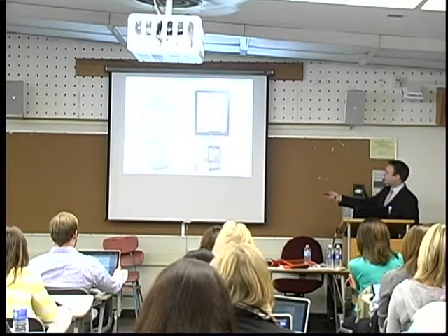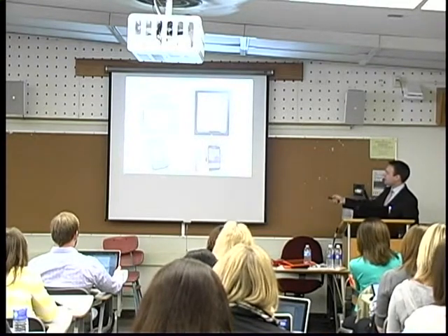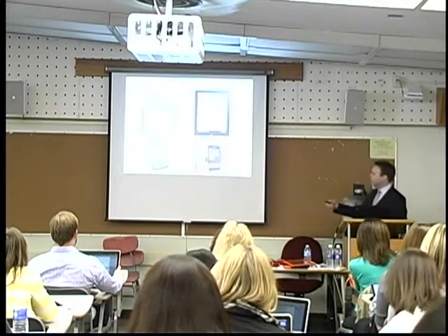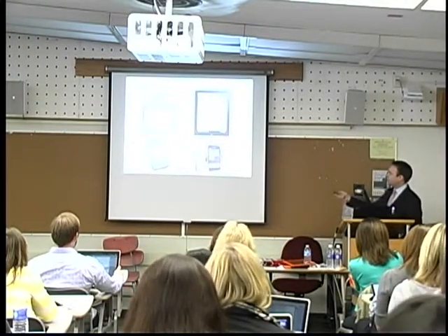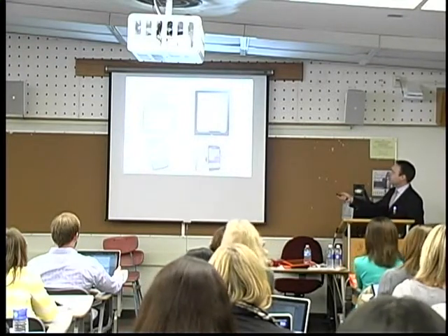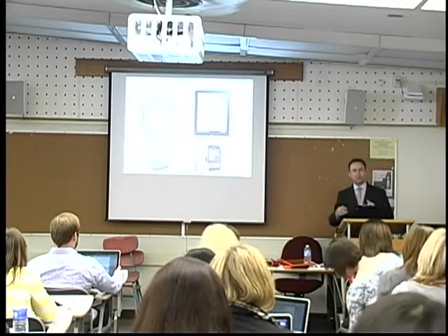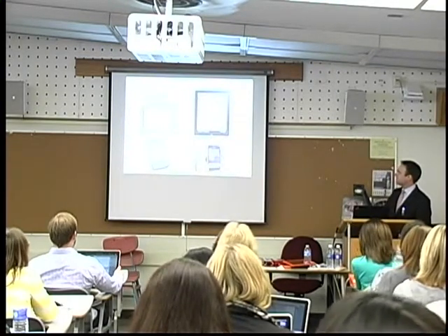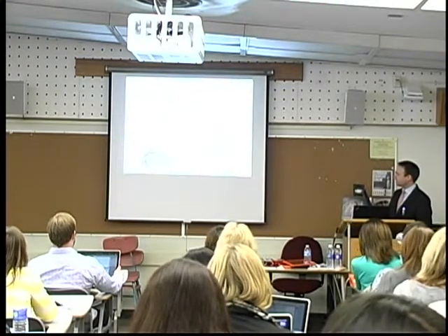Some are more portable than others, and there's a huge movement in the AAC community away from the dedicated devices onto using tablet devices that have just software on them that mimics a speech-generating device and turns that tablet into an SGD.